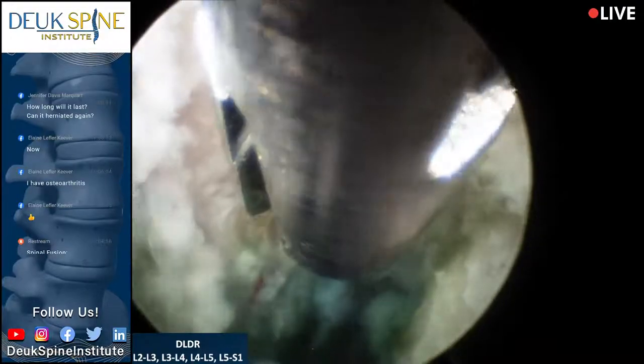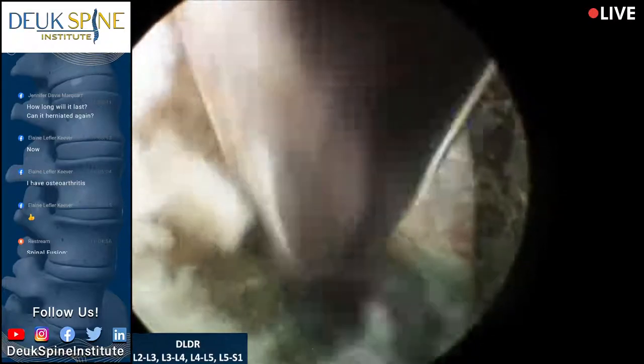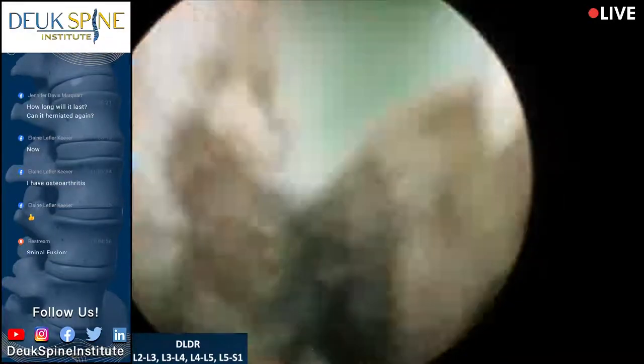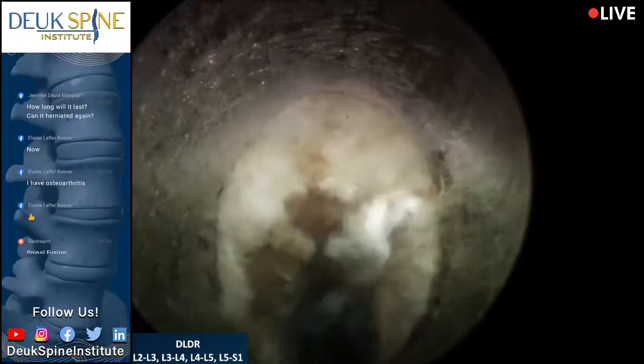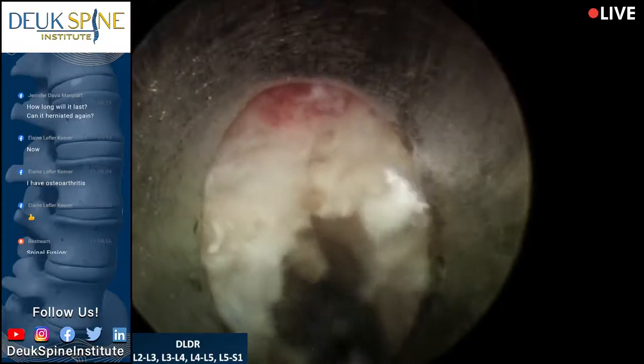There's bone right there. I'm touching that pink thing, there is bone. And then there's bone right there. And there's really nothing between them. The disc is gone. And my goal here is not to give him a disc. My goal is to get rid of his pain. Just about done, you're doing great. And the way we do that is by treating the annular tear right here.